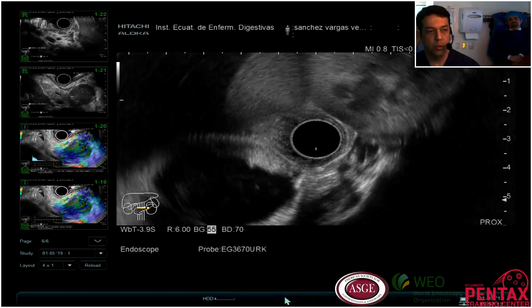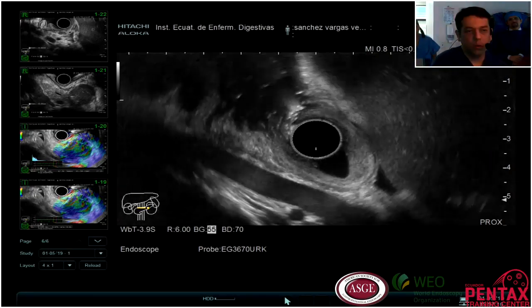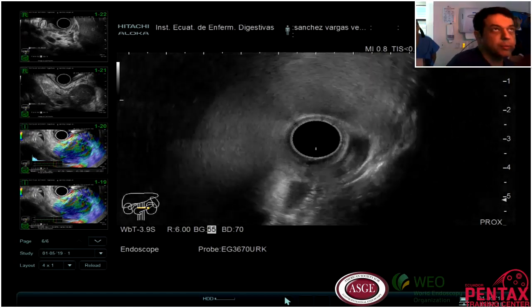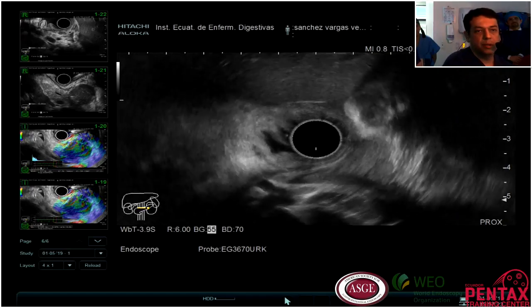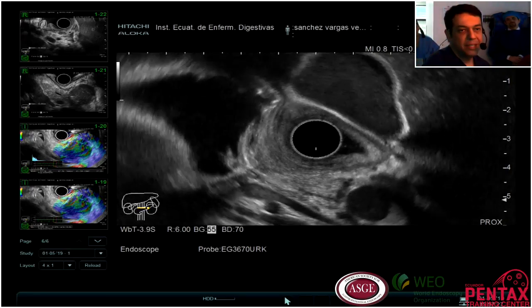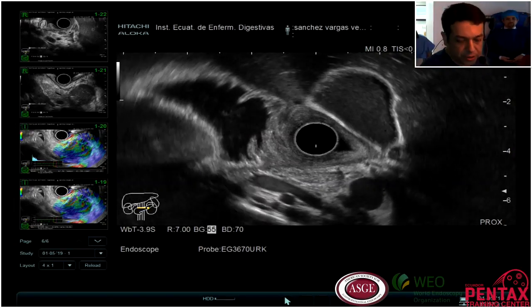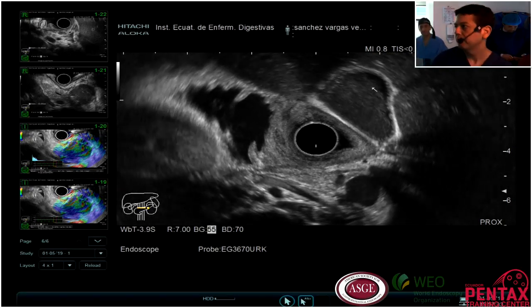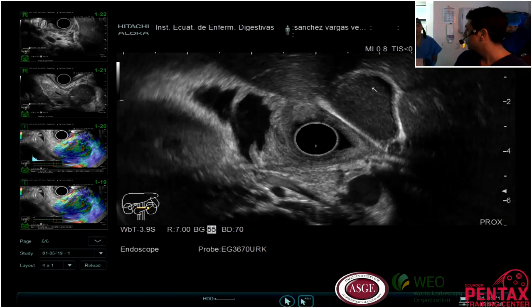But if we evaluate the whole situation of this patient, we need to see very well. So I want to see my gallbladder. If you see here, my gallbladder has a lot of sludge. So the case is very confusing.